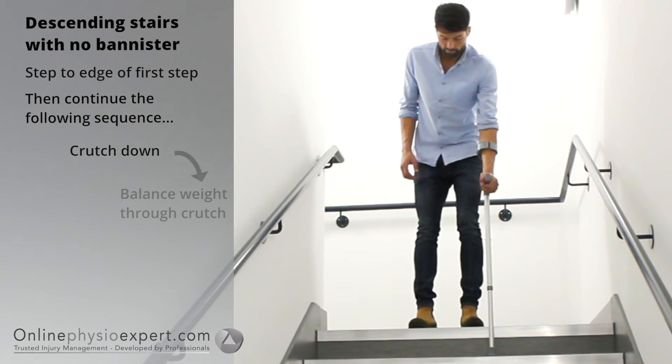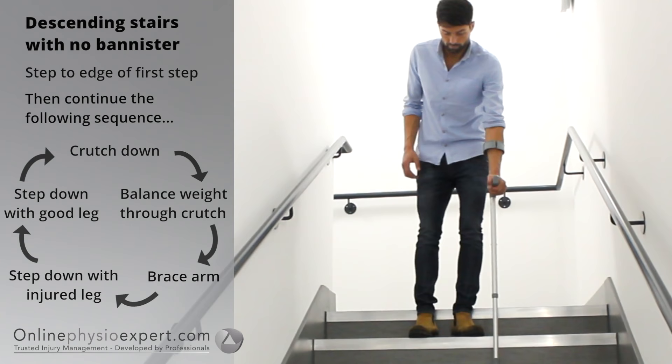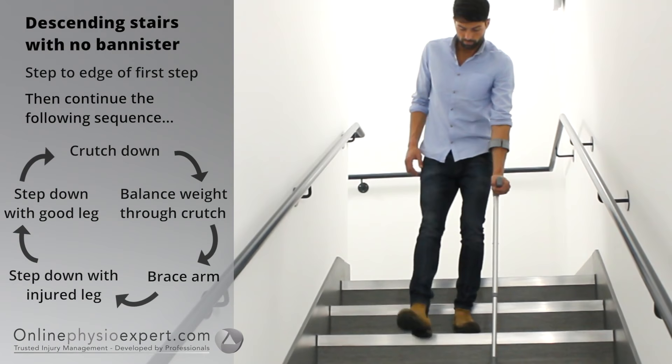To descend stairs with no banister, step your feet to the edge of the first step. Place the crutch down to the next step. Find your balance point through the crutch and step your injured leg down followed by your non-injured leg. Repeat these sequence of movements until you safely reach the landing.